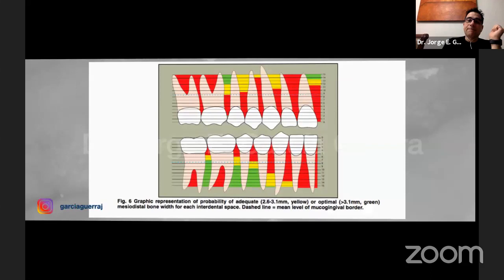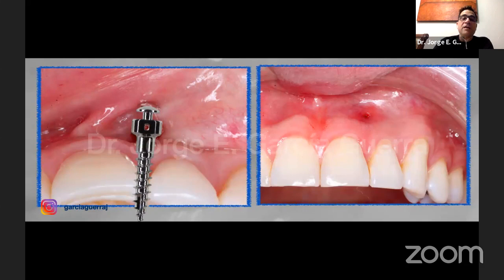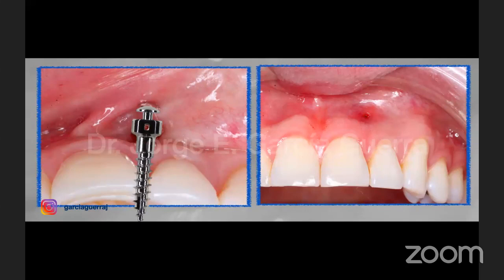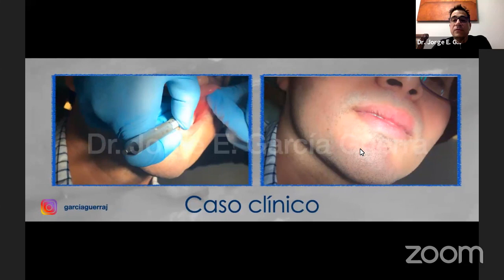Okay, we're going to see another case here where we put in a mini implant between the roots. Now it's very interesting. I'm going to put this slide up so we can understand that we're going to have a certain curvature there. When we're inserting the mini implant, we're going to have a curved arch, so we need to ideally position that screw. This screw we put in during practice at a seminar, in a course. So we inserted it and we removed it. I'm going to show you with this video.